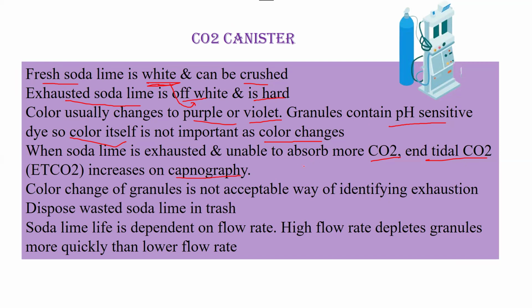So basically they are saying that measuring or seeing the carbon dioxide level through capnography is a far better way rather than seeing the color change of the granules, because color change in granules is not an acceptable way of identifying the exhaustion of the carbon dioxide canister. Rather, you should preferably see the end tidal carbon dioxide level on the capnography, so that is the more preferred way. But still, when the soda lime gets exhausted, its color changes.